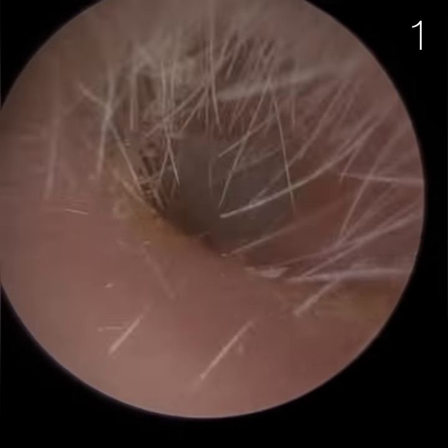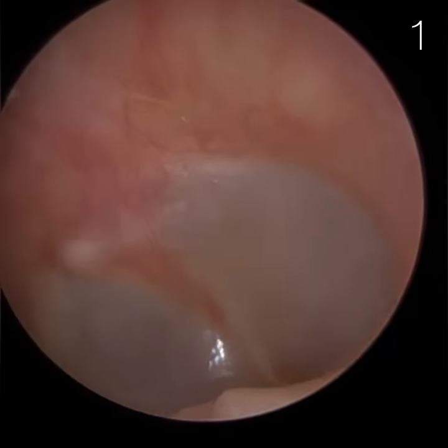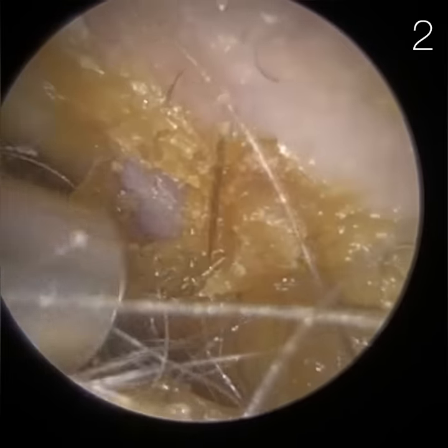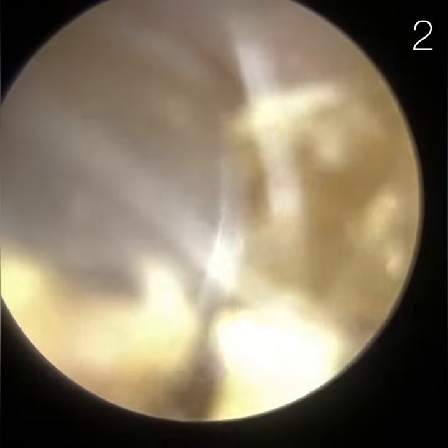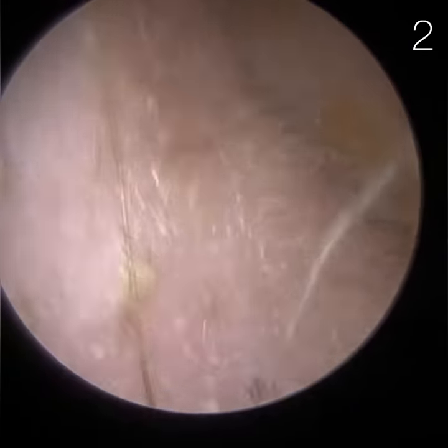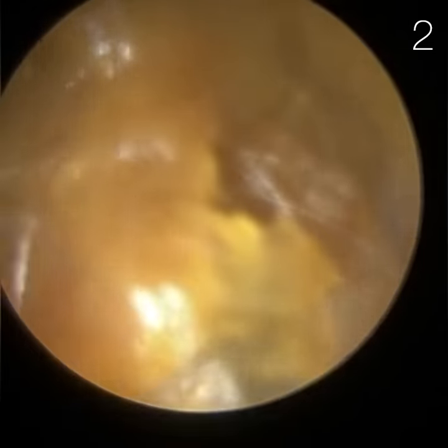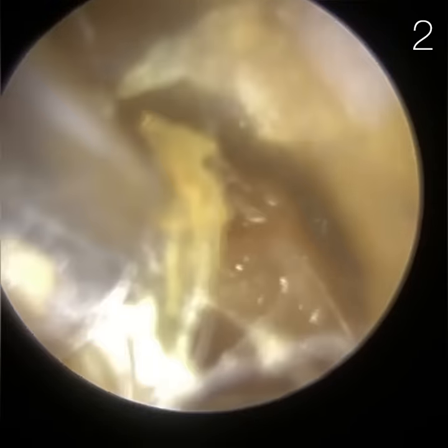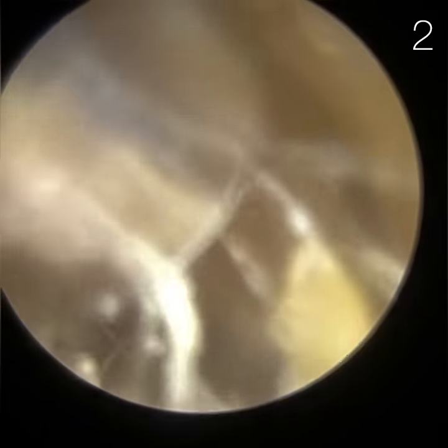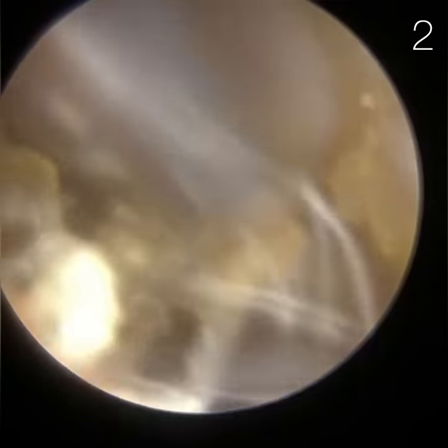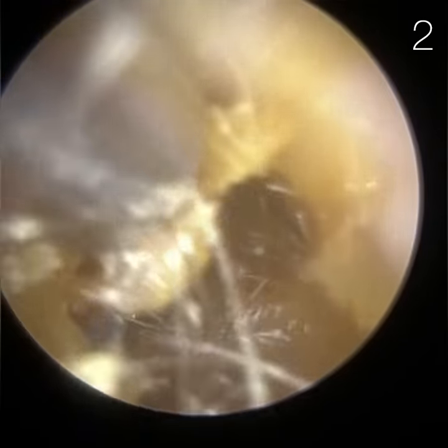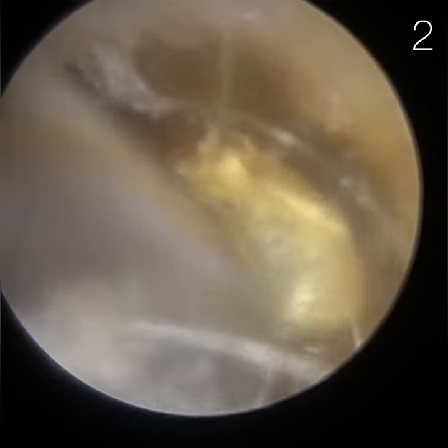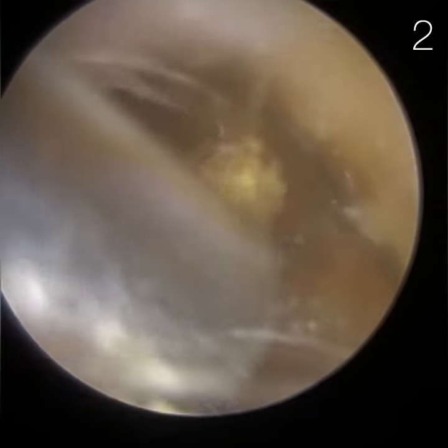It may even be some exostosis, very early stages. Exostosis is when you develop bony spurs in response to cold air or cold water, so it's also known as surfer's ear. When you're exposed to cold air or water, you experience dilation of the blood vessels in the periosteum, which is a sheath that lines the bony part of the ear canal. When the blood vessels dilate there, it initiates osteoblasts, which are specialist cells found on the surface of the bone involved in the formation of new bone. But in that case, there's nothing to be concerned of.